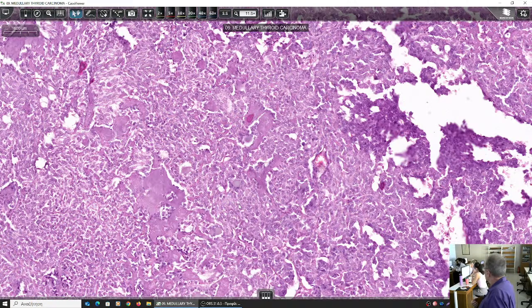When we have a tumor with homogeneous cells, we must look for neuroendocrine differentiation, because neuroendocrine tumors have mainly homogeneous cells when they are of low grade, previously known as carcinoids.